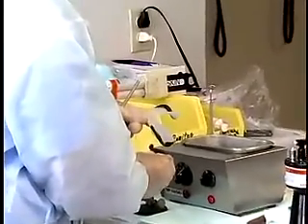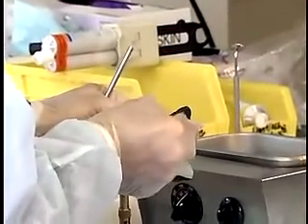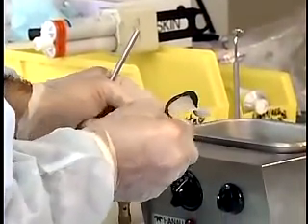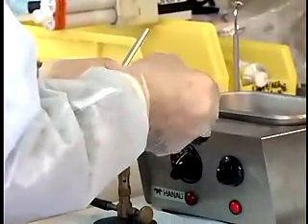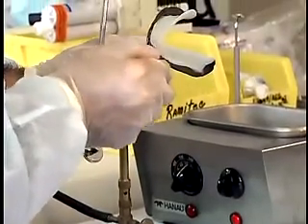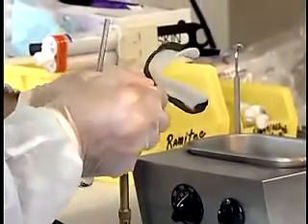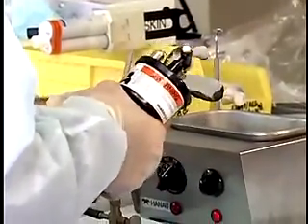Soften one end of the green stick compound slowly over the alcohol torch, and place the compound along the anterior border of the dried tray from the buccal frenum of one side to the buccal frenum of the opposite side. Add green stick compound to the sublingual crescent area, anterior lingual border. Temper and place in the patient's mouth.